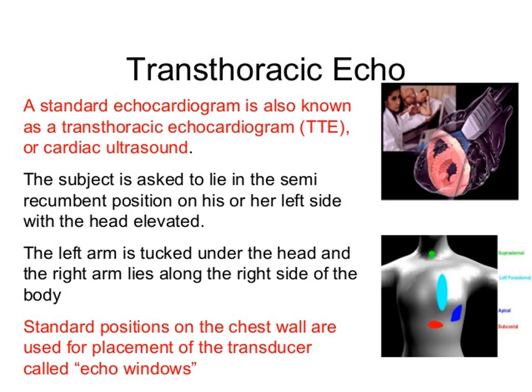Standard positions on the chest wall are used for placement of the transducer, called echo windows. Here they are. These are the windows for our probe.